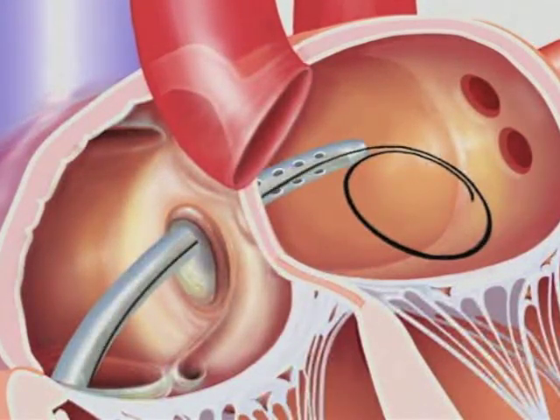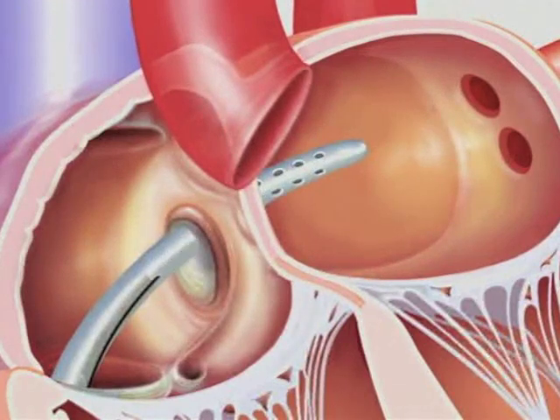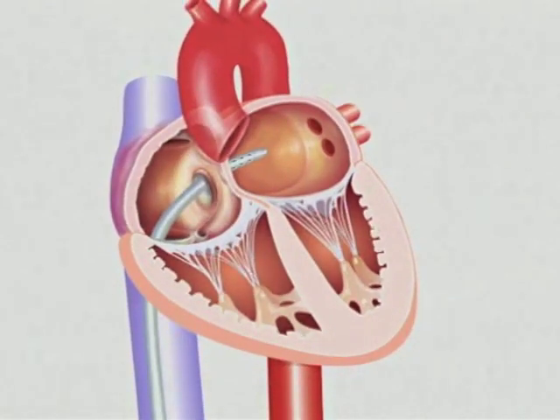First remove the guide wire and obturator until it is beyond the clamp area of the cannula. Then, leaving the hemostasis valve in place temporarily to control blood loss, clamp the cannula in the clamp area and remove the obturator, wire, and hemostasis valve from the cannula. Make sure the cannula clamp is securely in place.